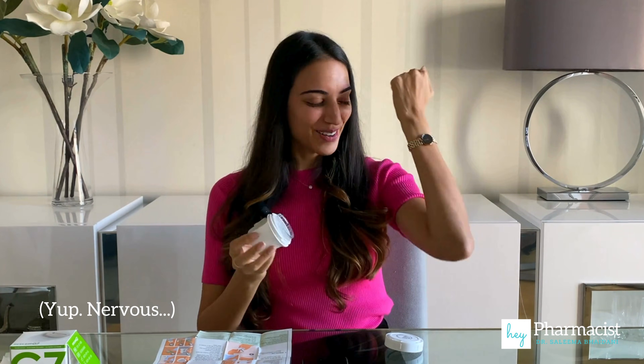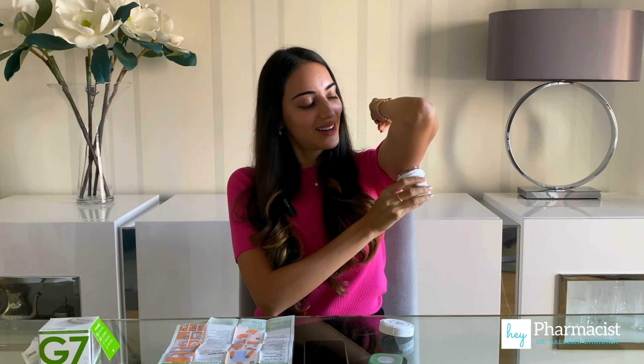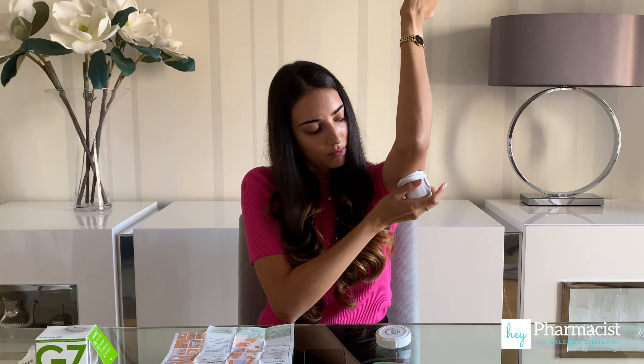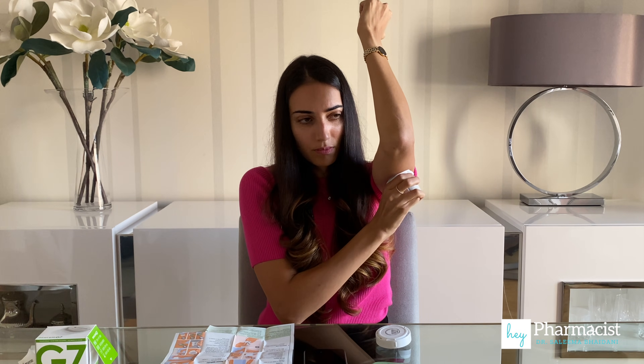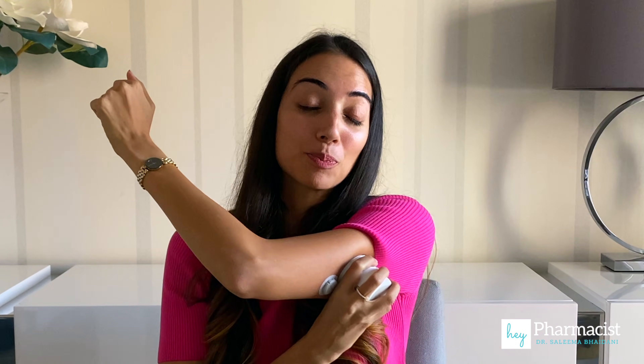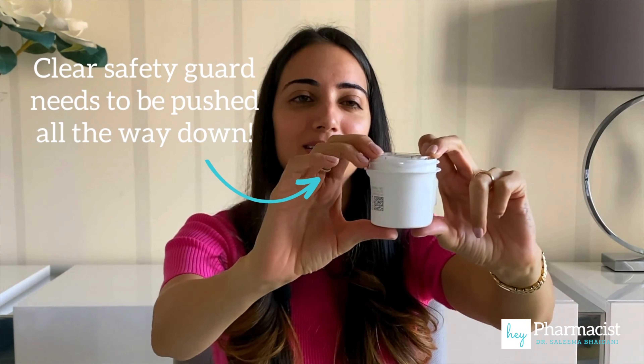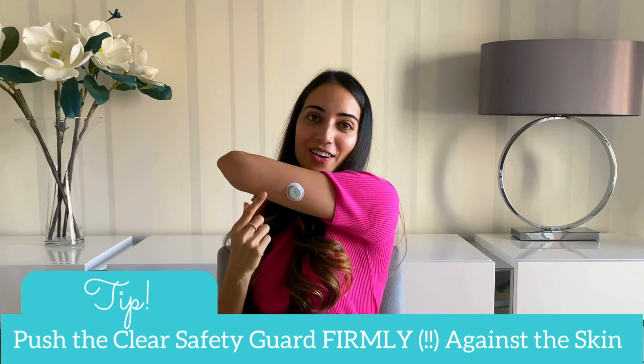Take the lid off — I know it doesn't hurt. One, two, three. Here's what I learned — maybe someone else will experience this too. Ensure that the sensor is really close to the skin and is pushed hard against the skin so that this plastic part here retracts and meets the white part of the applicator. The sensor is in. I've got the Dexcom G7, and actually that didn't hurt at all. I didn't really feel it.